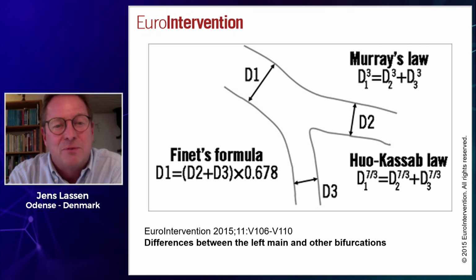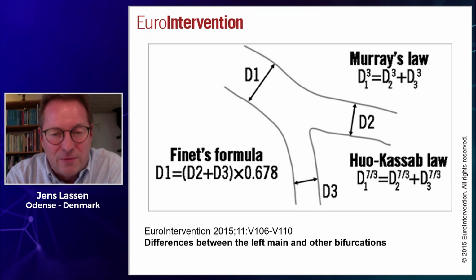And that means that if you should fit the stent, the device, to the biology of the patient and the vessel, then you have to manipulate the stent. And there's certain risk involved. But again, if you look carefully at the cartoon, you'll see that the distal diameter is smaller than the proximal diameter. So there are considerations on which pressure and to which diameter you should inflate the balloon and implant the stent. These are some of the very first basic steps in provisional stenting.